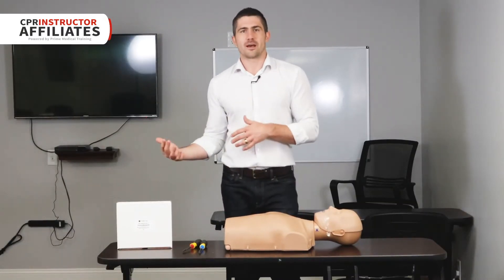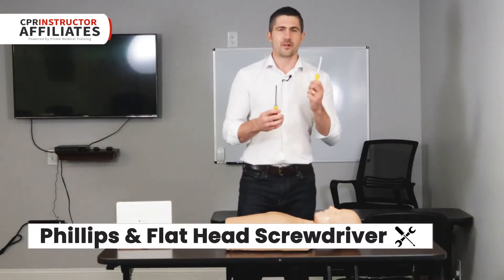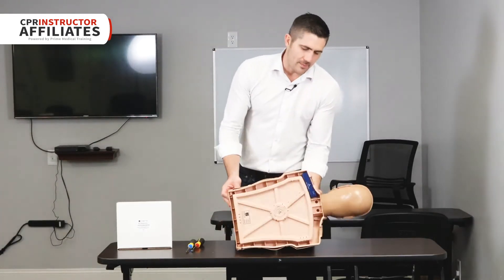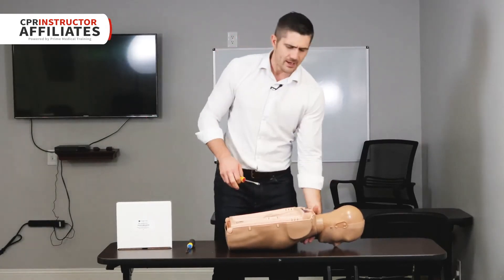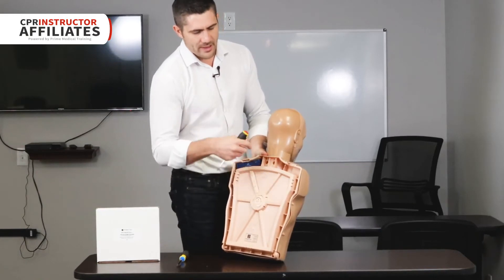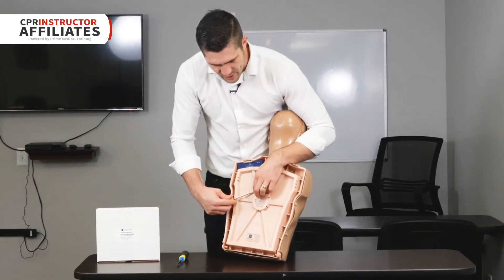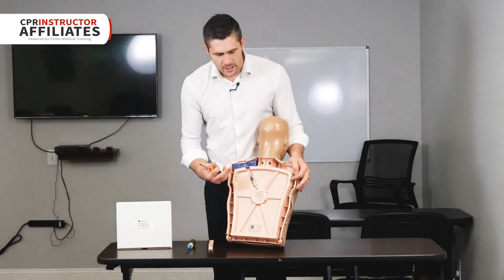All you need to do is have a Phillips and a flathead screwdriver. We'll start on the back end using the flathead. There's a little cover piece where the cable runs, so we need to remove that. There are already indentations where you can wedge the flathead in and it pulls right off, exposing the wire.